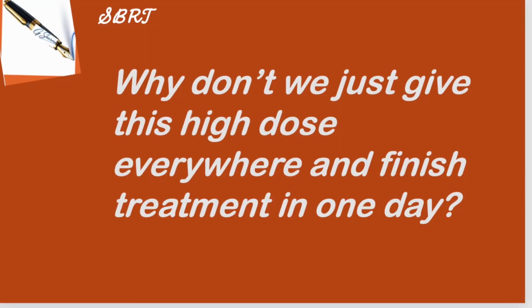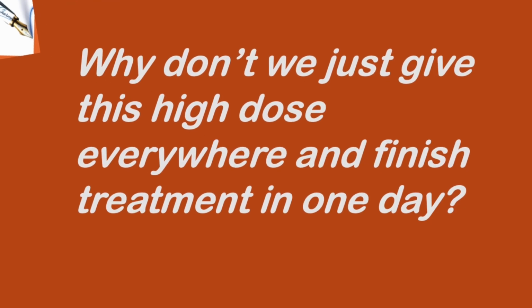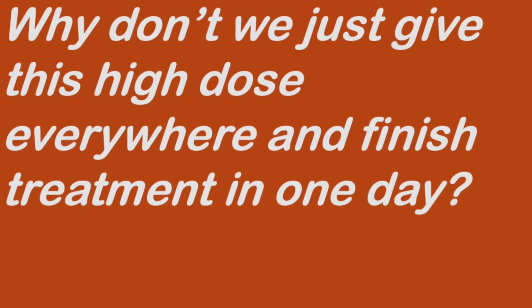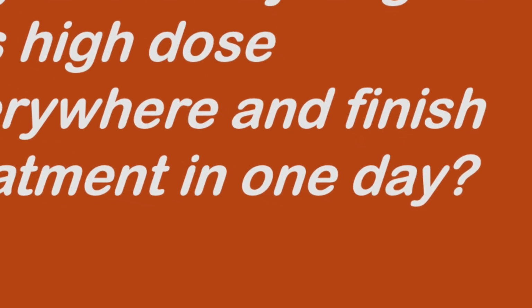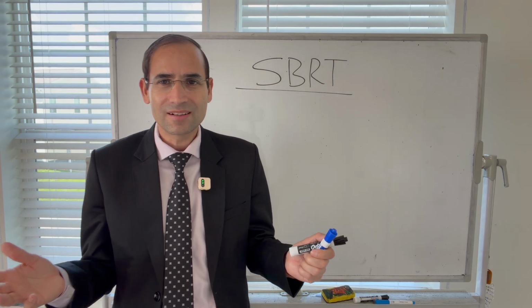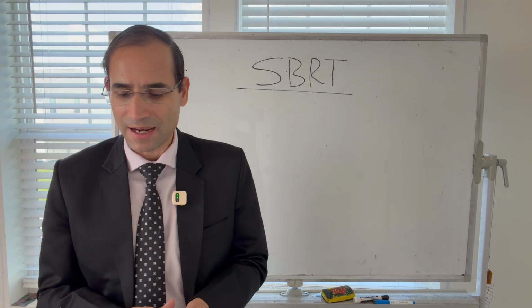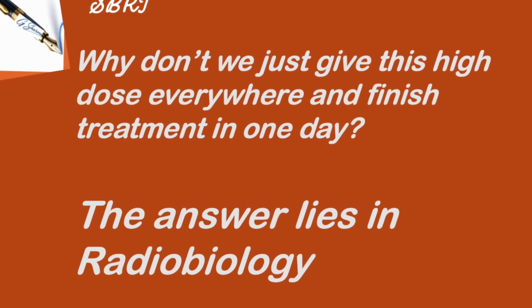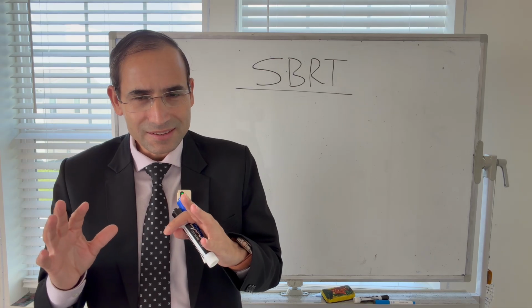So let me ask this: why don't we give this high dose everywhere and finish treatment in one day? Even though we are giving a high dose, we give it in fractions. Why are we not giving it in one day? That's the radiobiological effect, which I discussed many times in my previous lectures. It sounds efficient, right, giving all the radiation in one day?